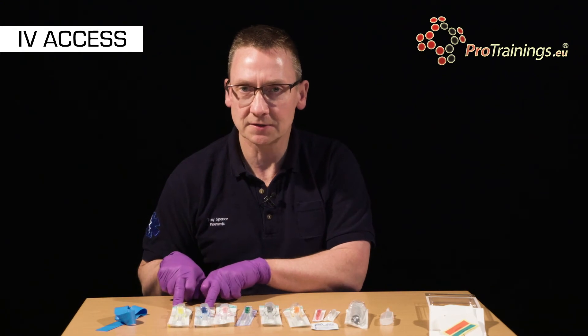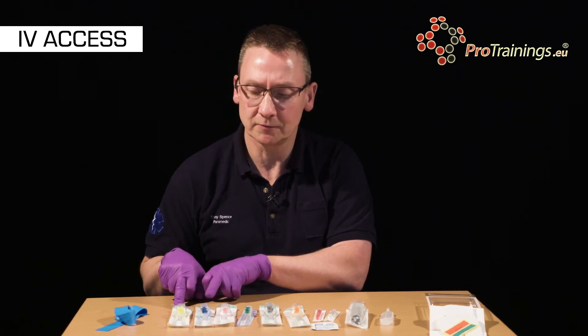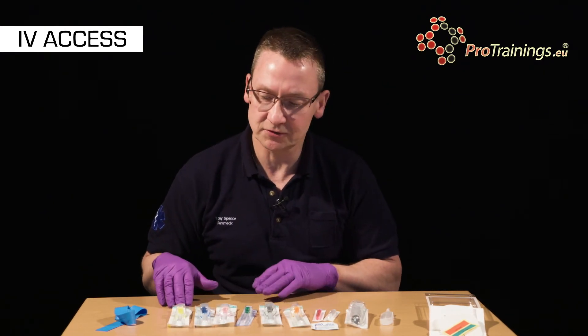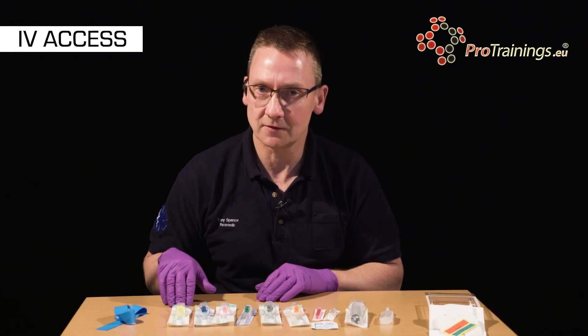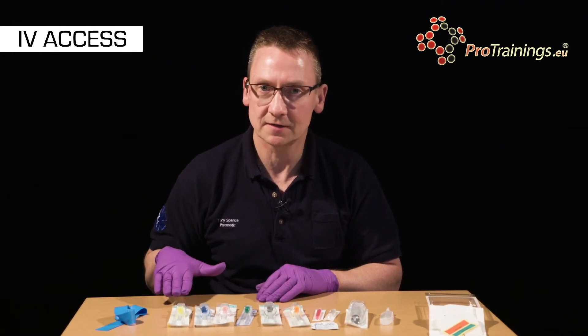For smaller patients and elderly people with fragile veins we would opt to use a 22, and for children perhaps a 24 gauge would be appropriate. However the flow rate for these is very slow.